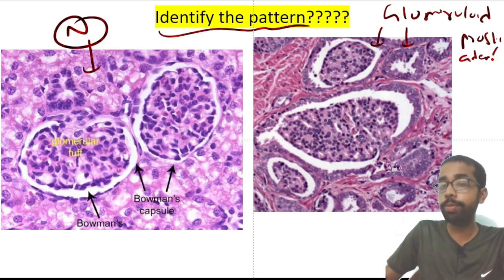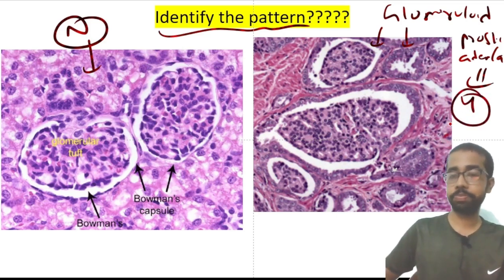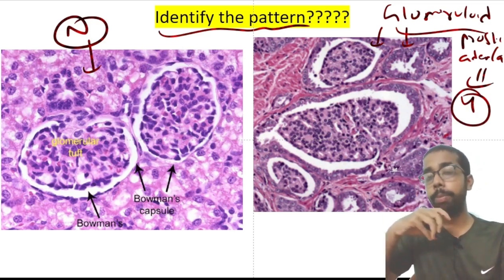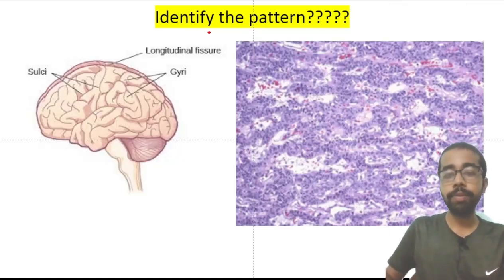Next question will be which grade? I mean glomeruloid, cribriform, what is the Gleason score you are giving? 4, right? Okay. And glomeruloid pattern you can also get in hemangioendothelioma. In papillary intralymphatic hemangioendothelioma, they will have papillary tufting, glomeruloid vessels, everything is there. That's the glomeruloid pattern.